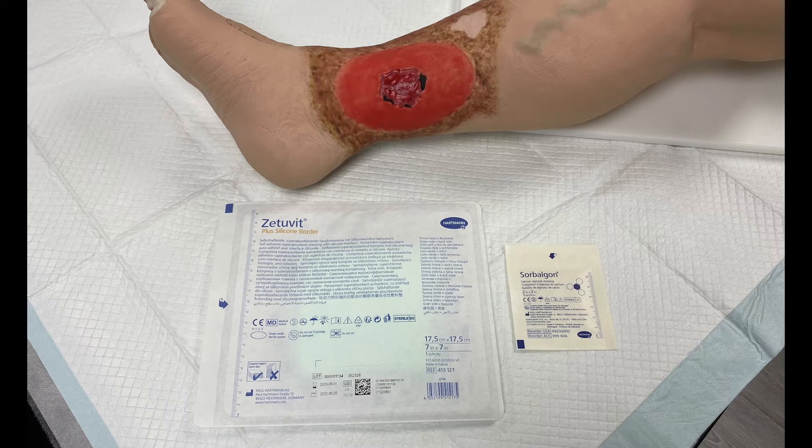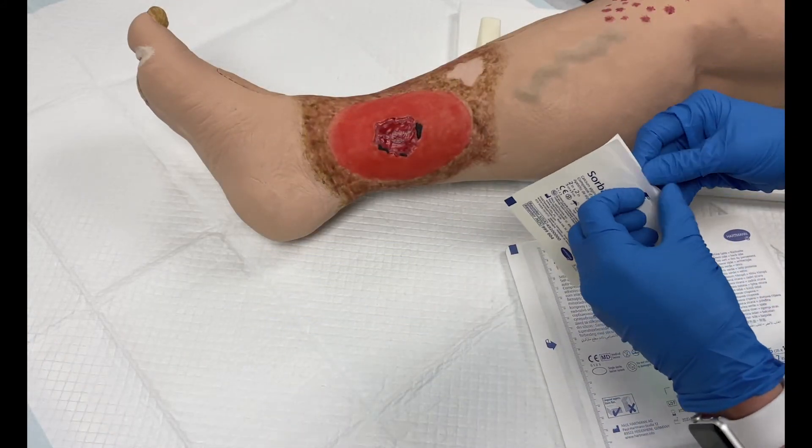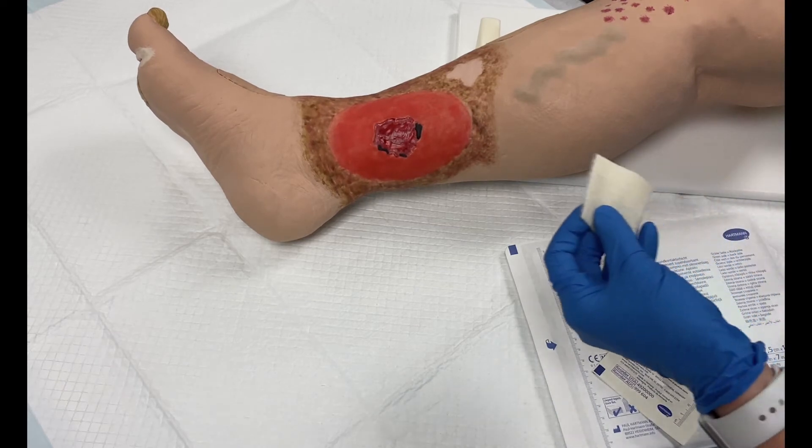Prior to dressing application, clean the wound using normal protocols and dry the surrounding skin. First, apply the Sorbolgon dressing. Remove Sorbolgon from the package and cut it to fit the exact wound size.